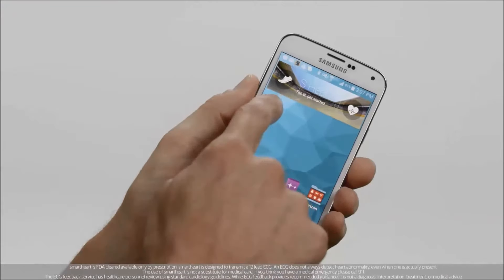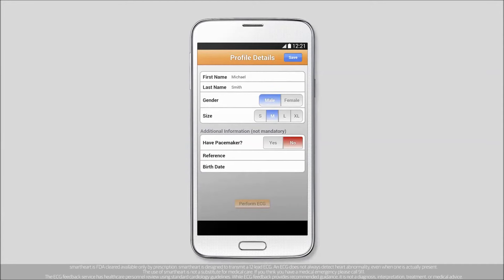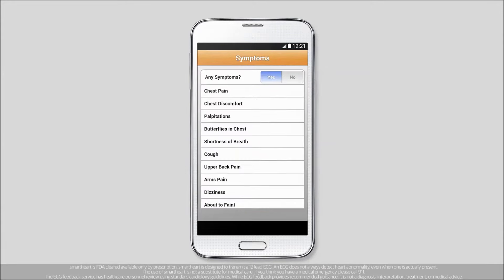Launch the app on your phone or tablet and tap Perform ECG. If it's your first time, you'll need to type in your size. You'll be asked if you're experiencing any symptoms. Please take the time to report them by checking the relevant symptoms on your screen.